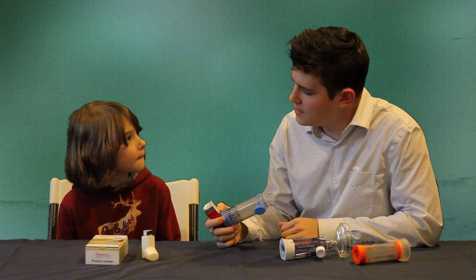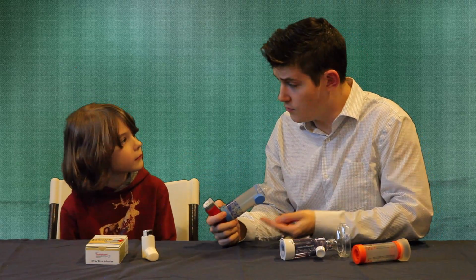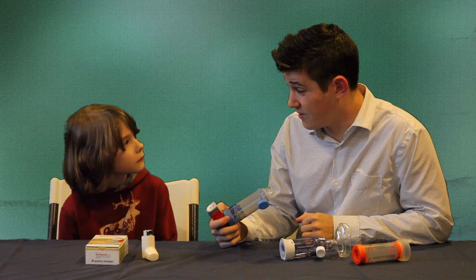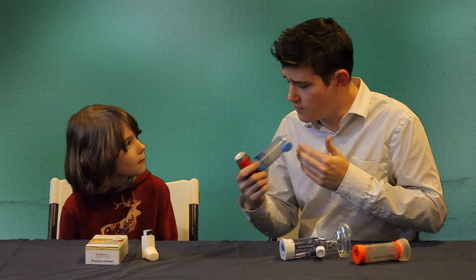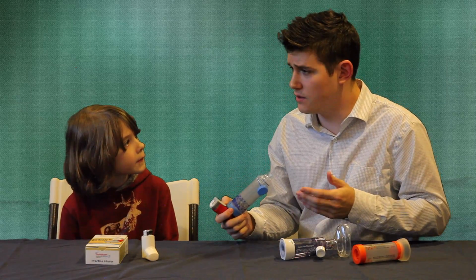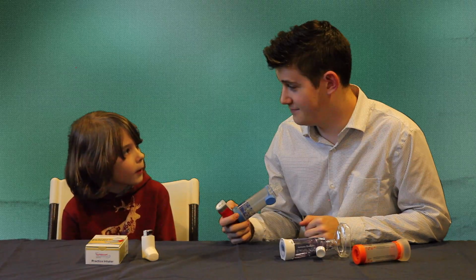Okay, X, do you know how to count to 10? Yeah. Awesome. So after you breathe in, you need to hold your breath for 10 whole seconds. And when you're doing that, you can leave the spacer in your mouth or out. It doesn't really matter as long as you hold your breath for that whole 10 seconds. Okay.